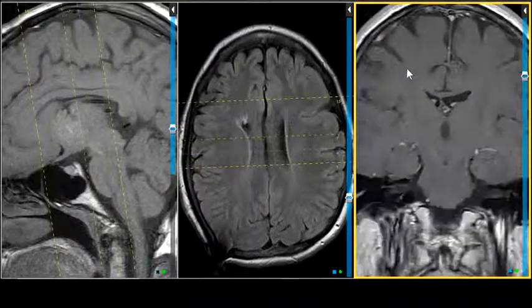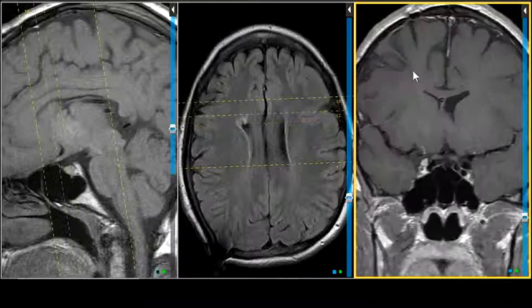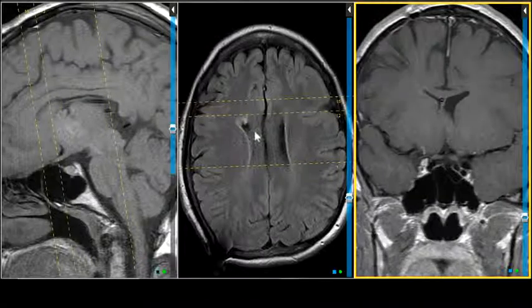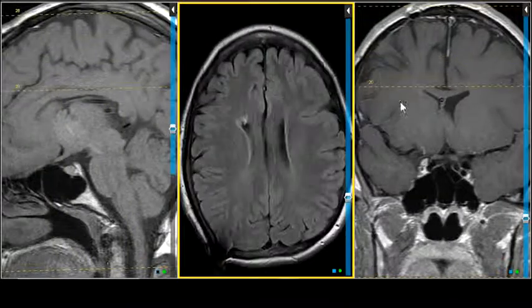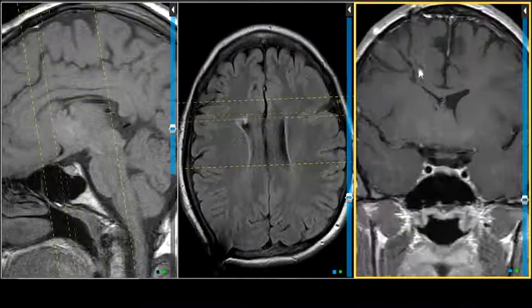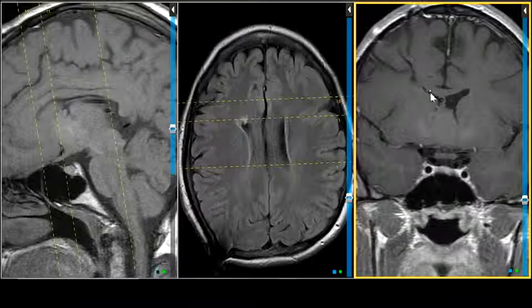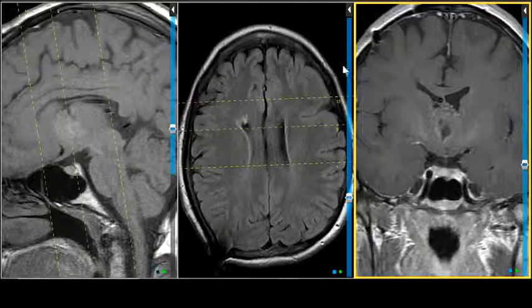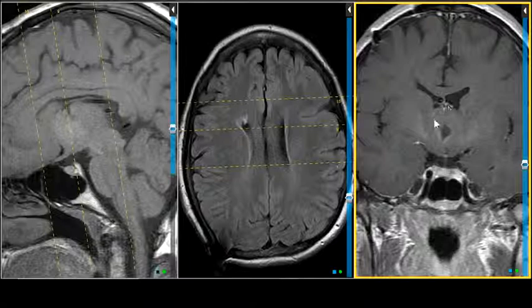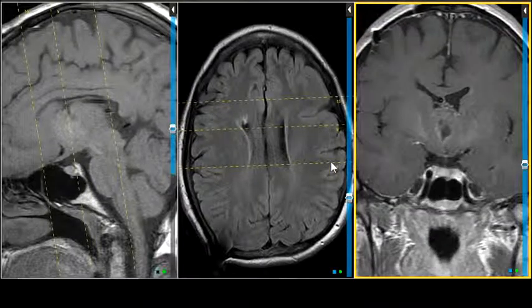Sure. Now, another issue is, so this was treated, and we've already talked about some approaches, but what's this up here? Was this a shunt tube that was put in? And I think the answer to that is no. I think what happened here is there's a craniotomy over here, and then there's an area of encephalomalacia leading to the ventricle. So there was a transfrontal approach to the ventricle taken to try to remove as much of this lesion as possible. Looks like they hollowed out a little bit right in the middle. Put your arrow right over there. But it's kind of in the third ventricle.